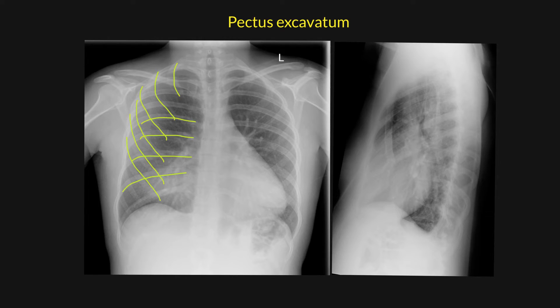If you look on the lateral view, you can see that the sternum is depressed. Here is the sternum, and it's clearly depressed with respect to the anterior chest wall.